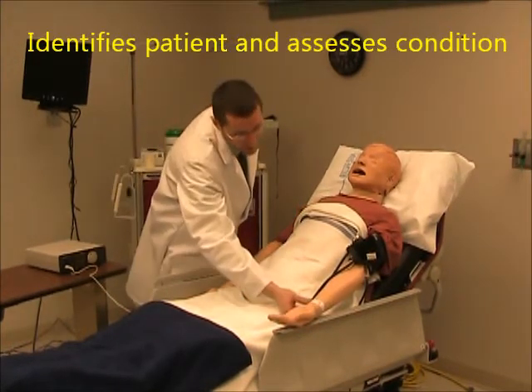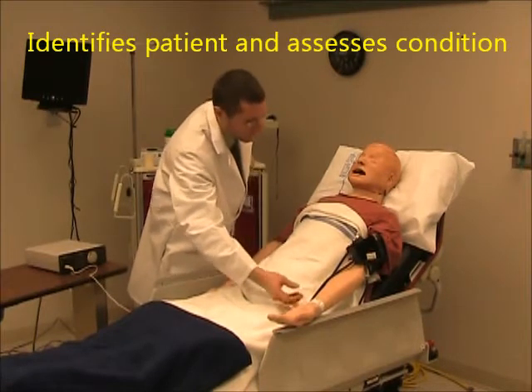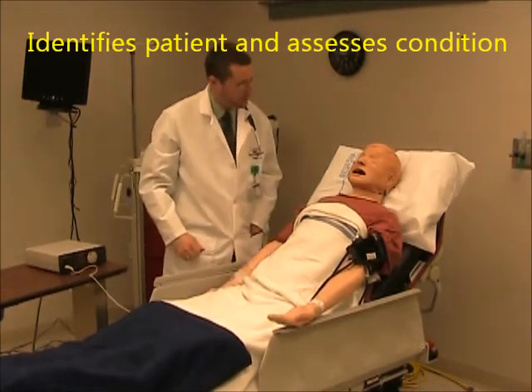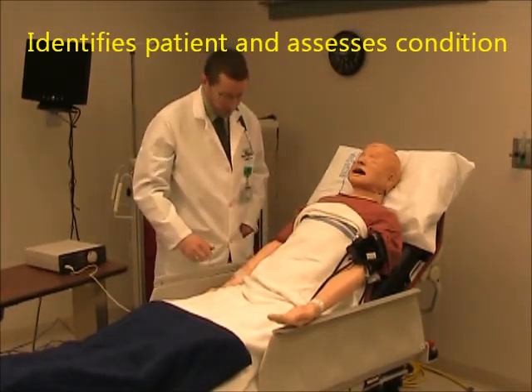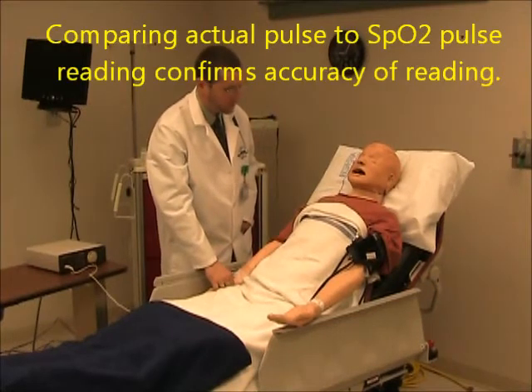Let me just check your name. I'm going to check your pulse just to verify that the machine is operating correctly and picking up the right pulse for you.